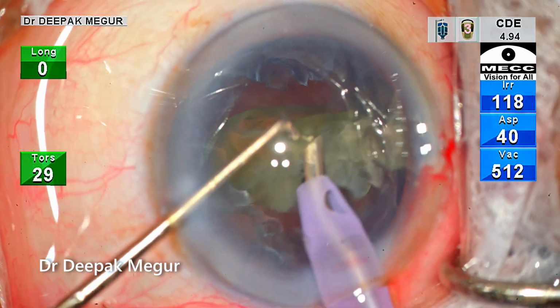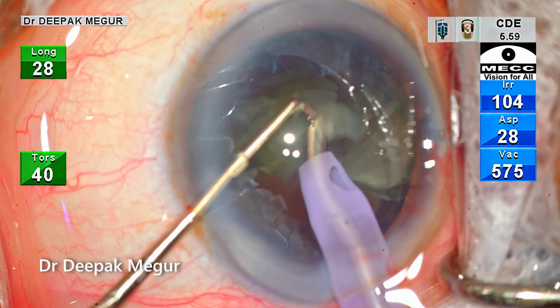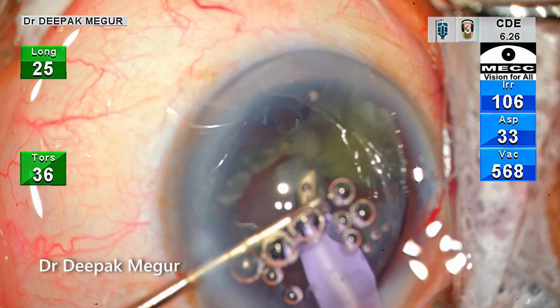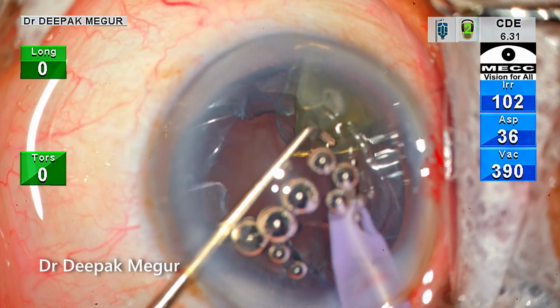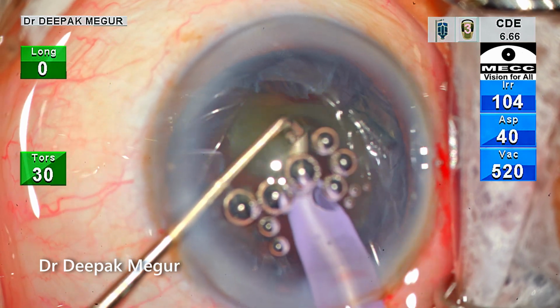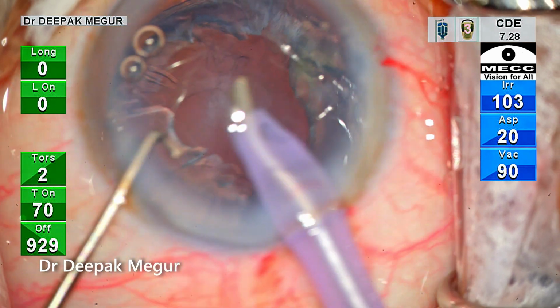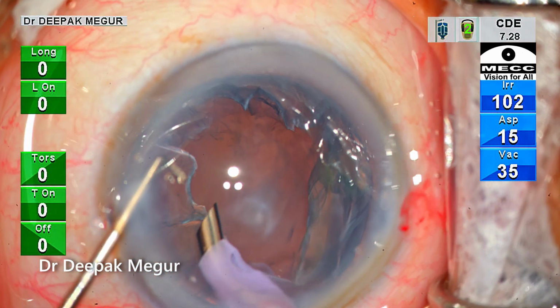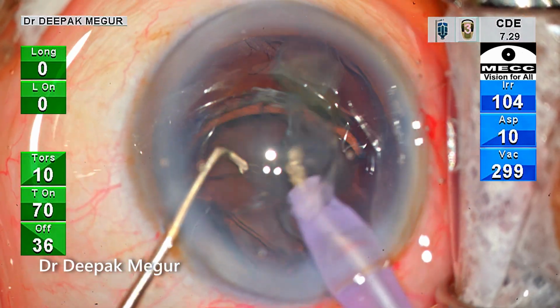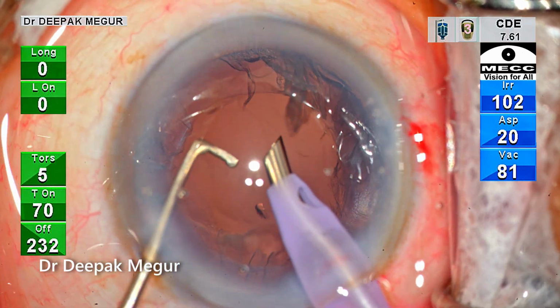The only issue here is that beginners might find it intimidating to pass the chopper under the rhexis and beyond the equator, because that is the key here. The chopper has to go and hook the equator of the nucleus. If you can do that, then it becomes an extremely easy technique. The epinucleus is then aspirated out. So the nucleus management could be finished quite easily and fast.